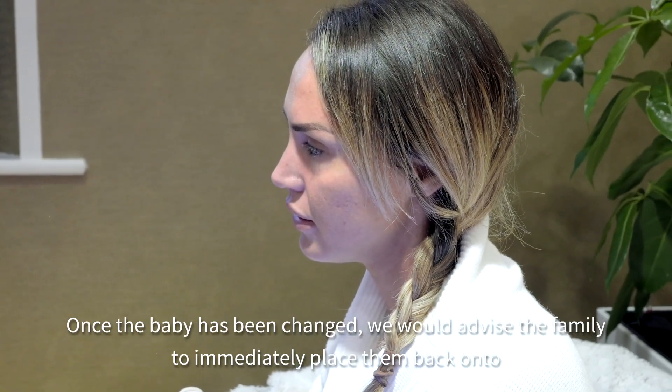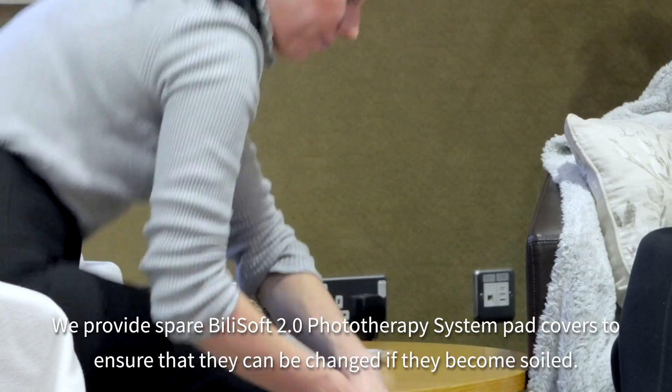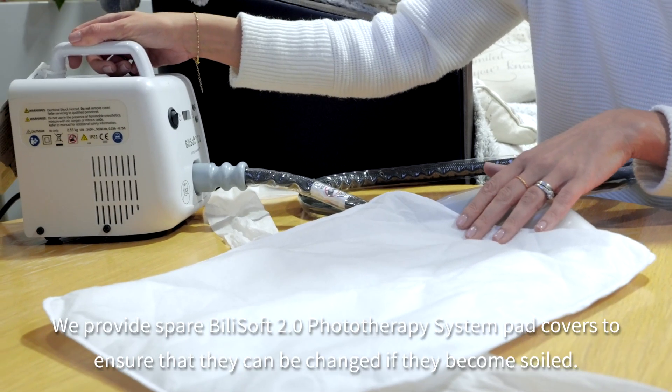Once the baby has been changed, we advise the family to immediately place them back onto the Bilisoft phototherapy system. We provide spare pad covers to ensure that they can be changed if they become soiled.